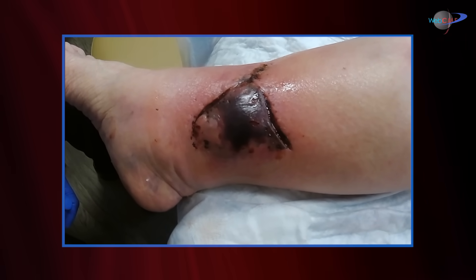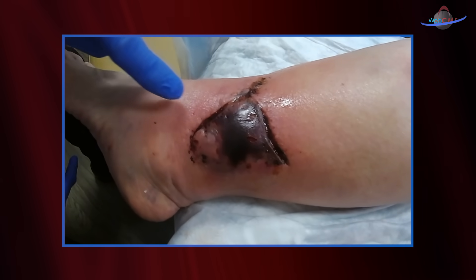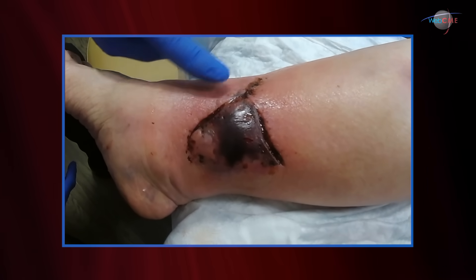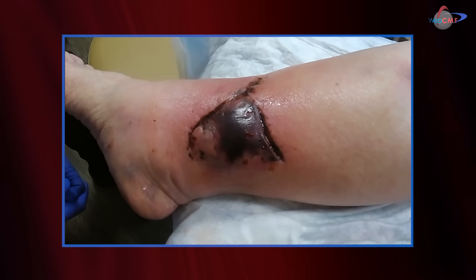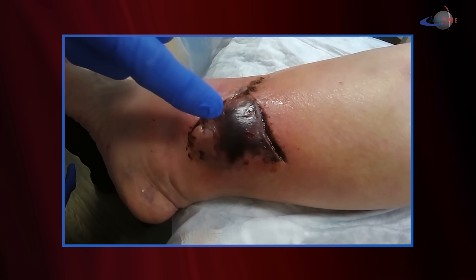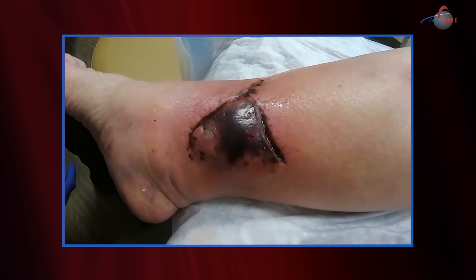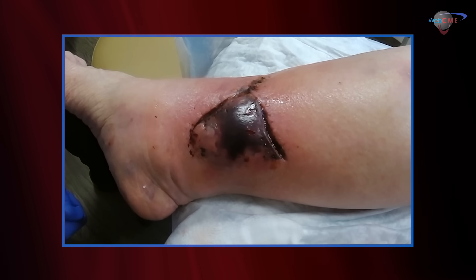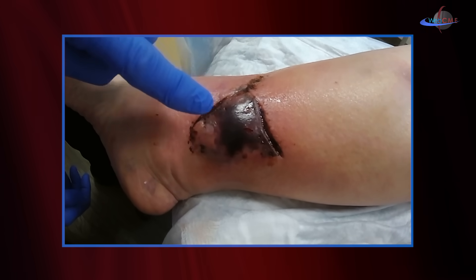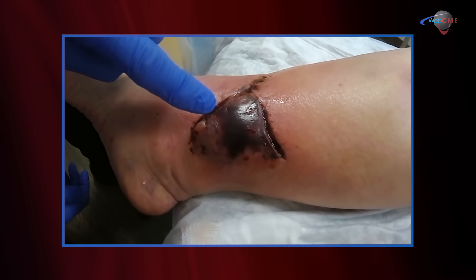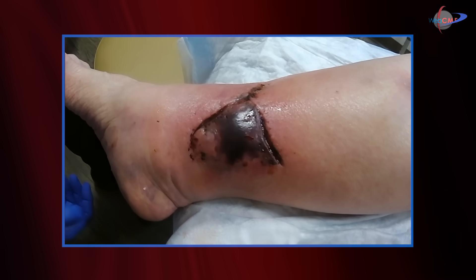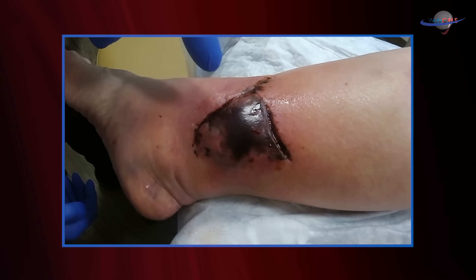Her concerns are persistent tenderness and erythema in the area. As you'll note, the tissue is still moderately inflamed and red. She's actually wincing as I touch her, demonstrating the pain associated with this area. You'll also notice that this is a necrotic part of the flaps. My suspicion — not only from an infection standpoint but from a tissue standpoint — is that this flap is heaped up, highly suspicious clinically for either a seroma, hematoma, or potentially an abscess sitting under that flap, raising it against the subcutaneous bed, causing decreased tissue perfusion and ischemia, resulting in necrosis of the flap.